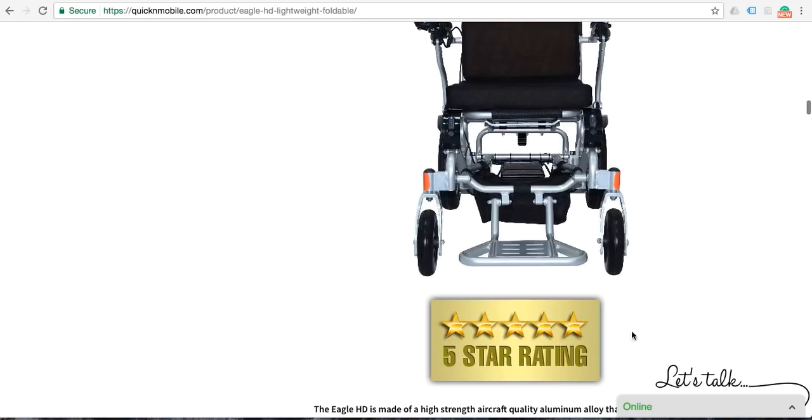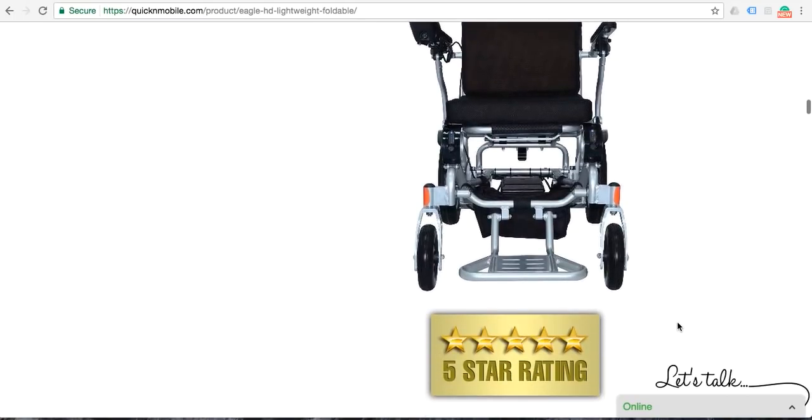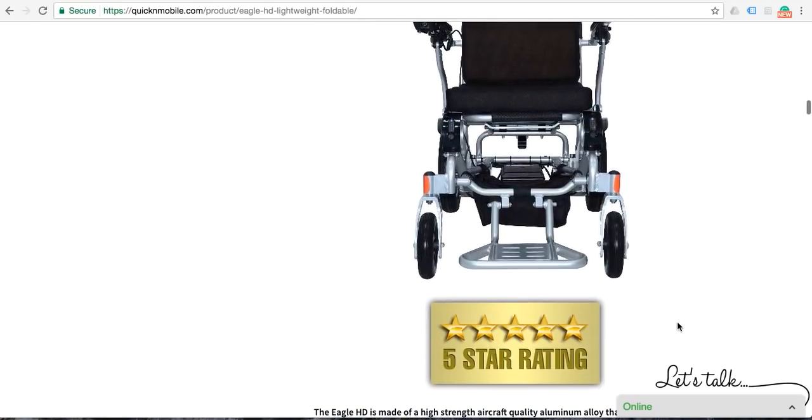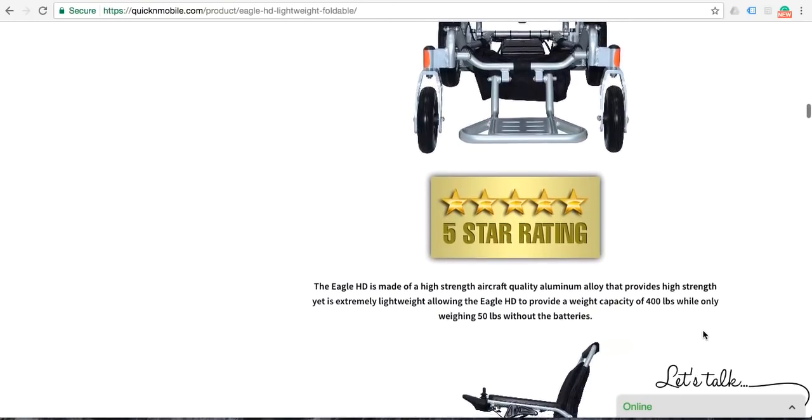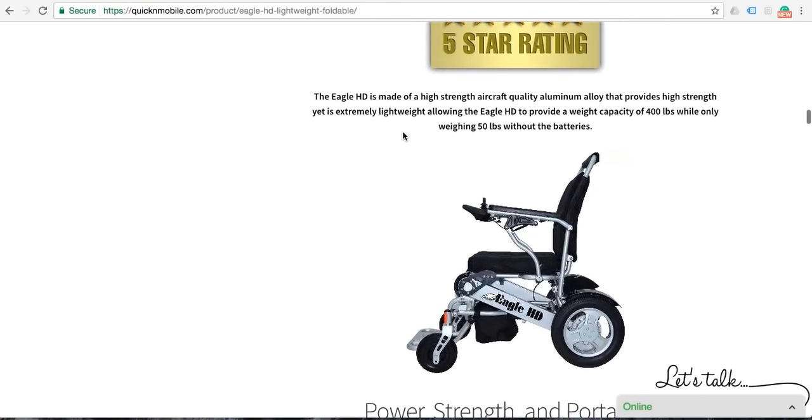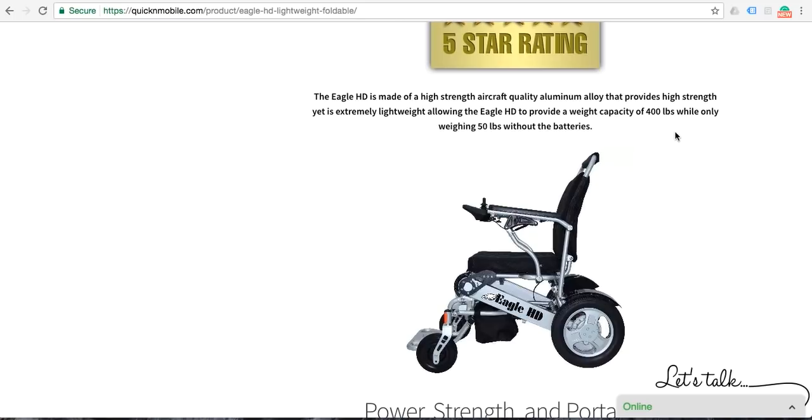In my opinion, it's very easy to see directly from the jump why this chair has been given a 5-star rating. The construction is, as you would expect, made of high-strength aircraft-quality aluminum alloy that provides high-strength yet extremely lightweight features for the Eagle. Of course, as mentioned, it has a weight capacity of 400 pounds while only weighing 50 pounds without a battery. Each battery is only 4 pounds.